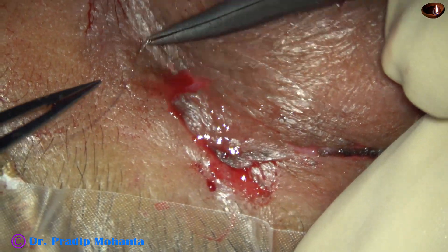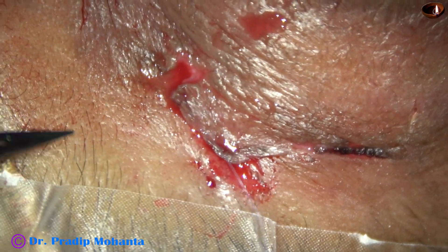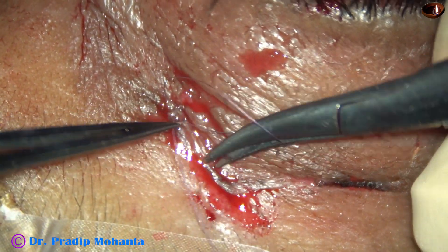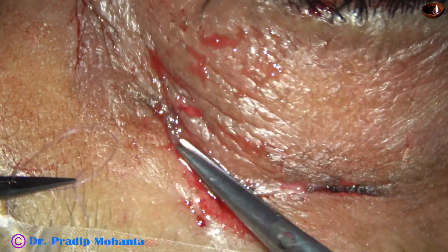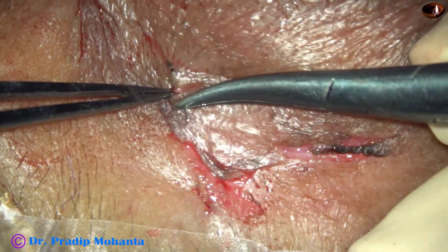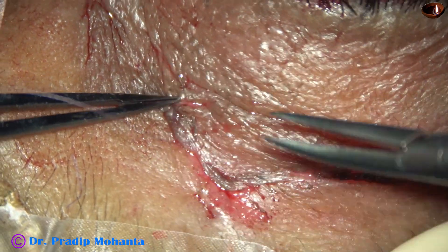Now, here it is very important. This is a two-in-one suture — first two throws, then one throw. And one more interrupted suture is being placed here for better opposition of the wound lips.